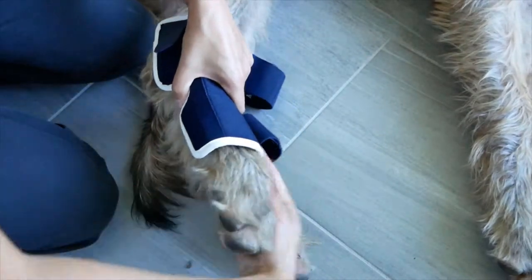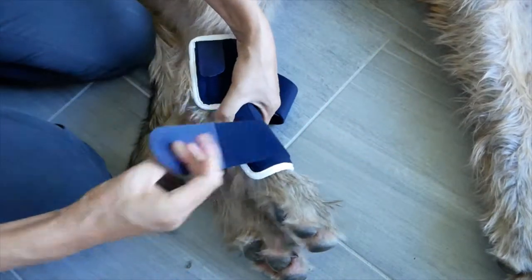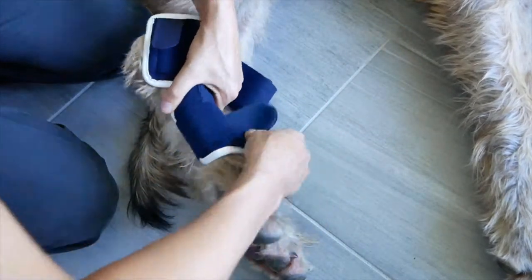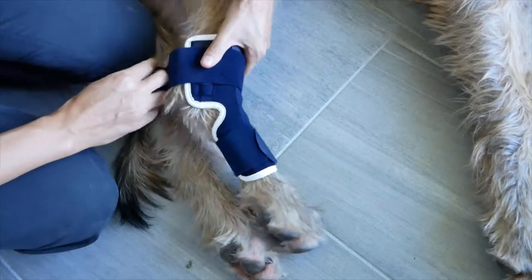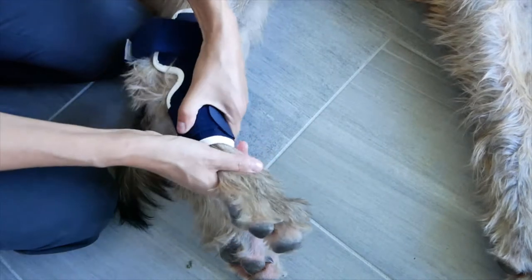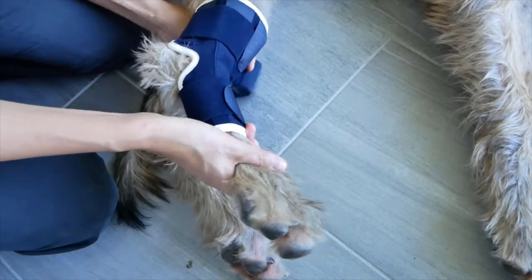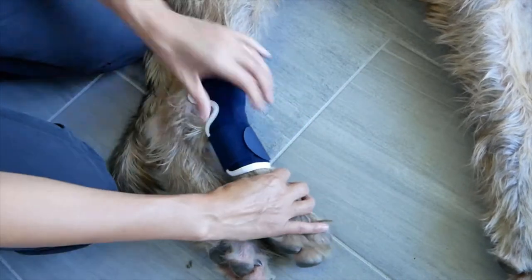Please remember, when the splints are present to increase the level of support, it means that your dog has a serious injury. Your dog needs rest to heal. It's usually recommended to control the amount of exercise. This means no running, jumping or trotting when your dog wears the brace with the splints.